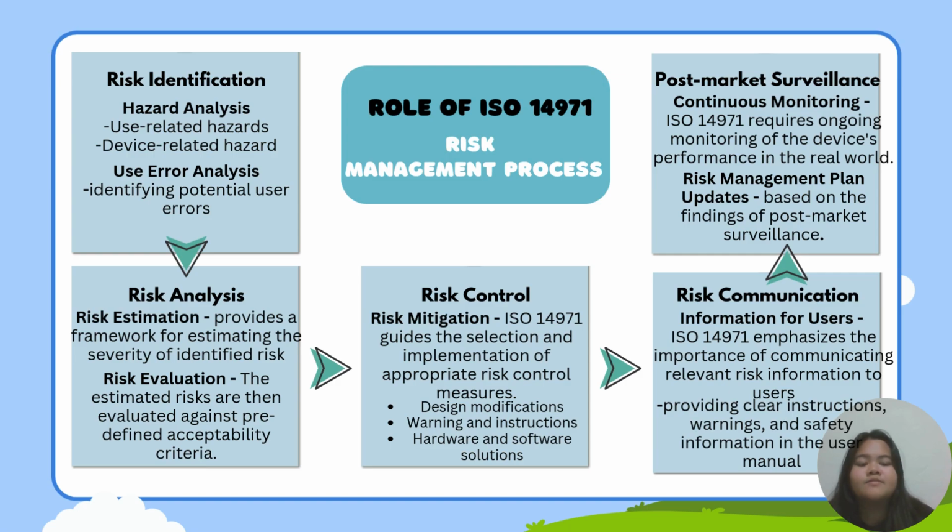The standard may provide clear instructions for use, developing operator training programs, and incorporating warning messages. The third one is hardware and software solution. This involves implementing safety features like automatic shut-off mechanisms and incorporating error detection systems.